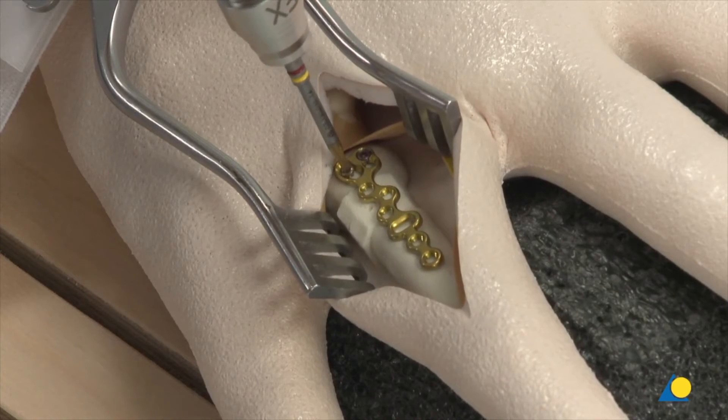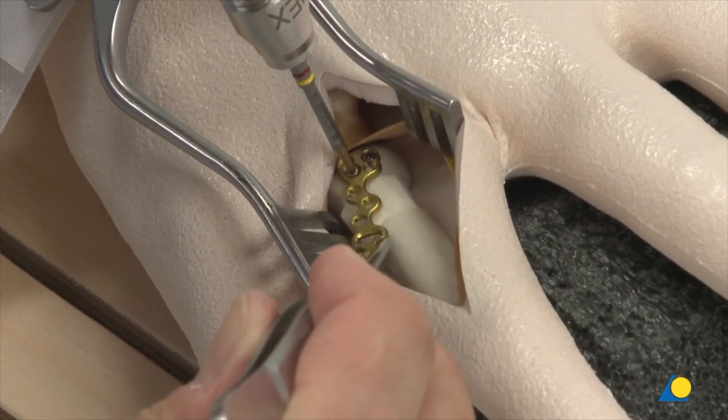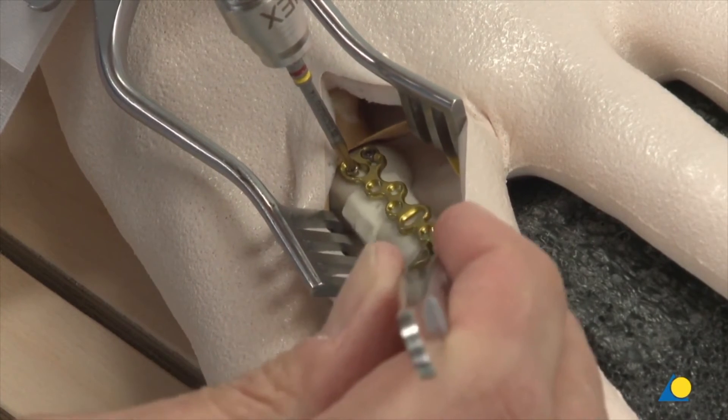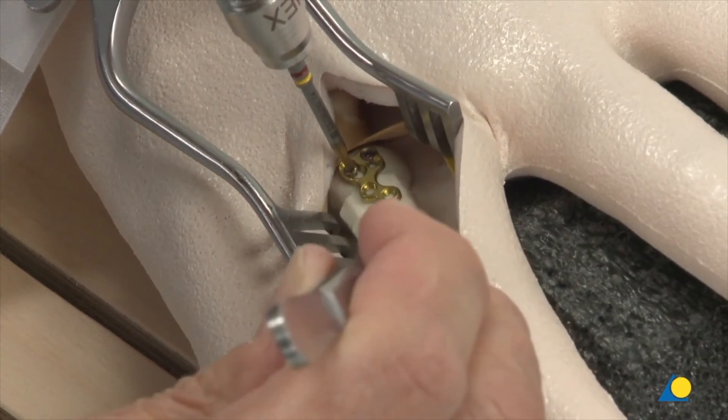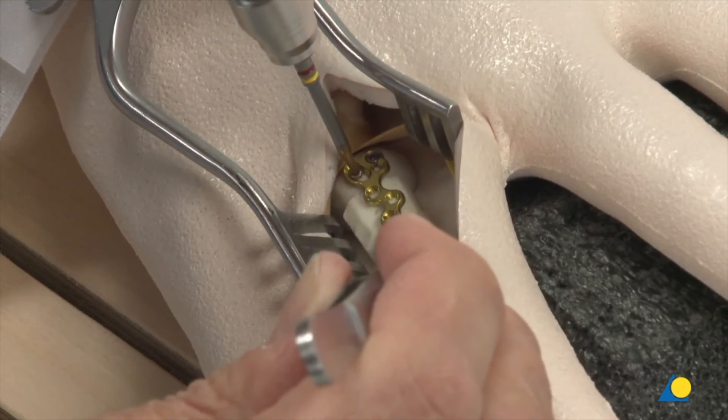The cortex screw is not fully tightened in order to provide subsequent plate adjustment. After the plate has been adjusted, the screws are fully tightened.